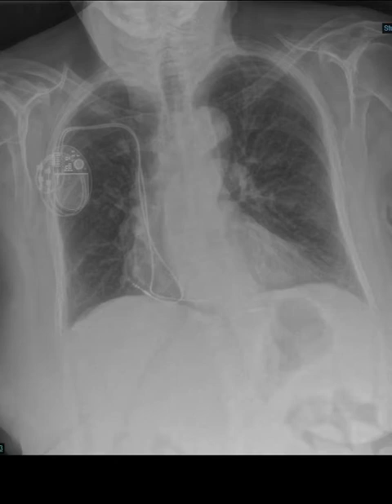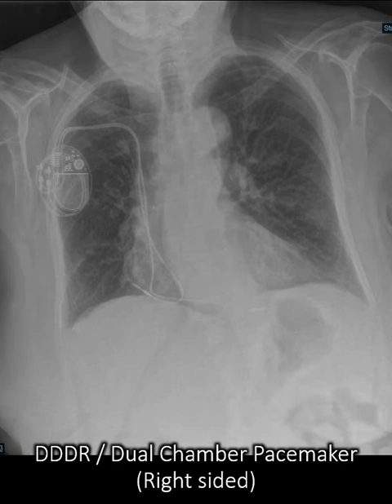So with that in mind, what device is this? Is there a thick coil that looks markedly different from the other bits of the lead? It's always a bit challenging with the spine, but the appearance is the same all the way down — therefore this is a dual chamber pacemaker and it's a right-sided device.